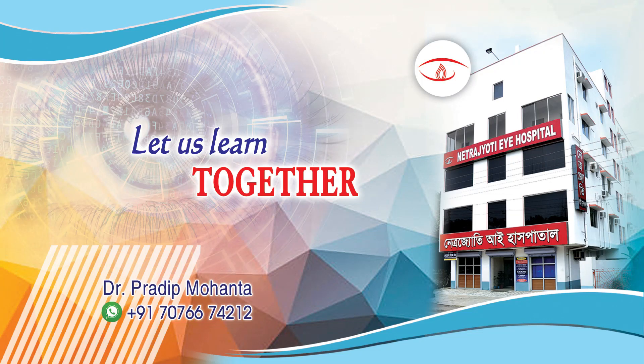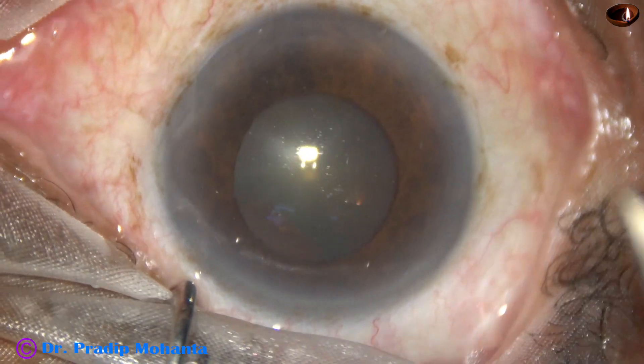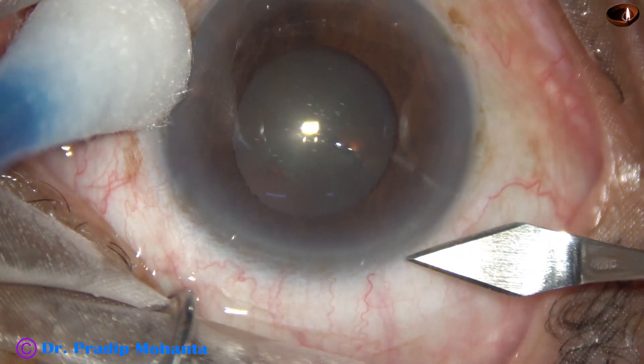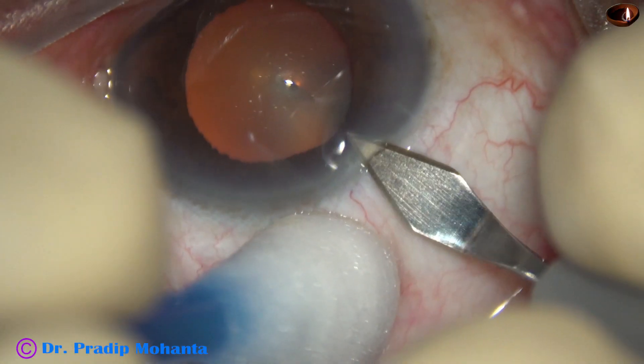Friends, welcome to my workplace at Ranagha, West Bengal, India. This is a cataract with a small pupil. The size of this pupil is about 3.5 mm. Let us observe this surgery.